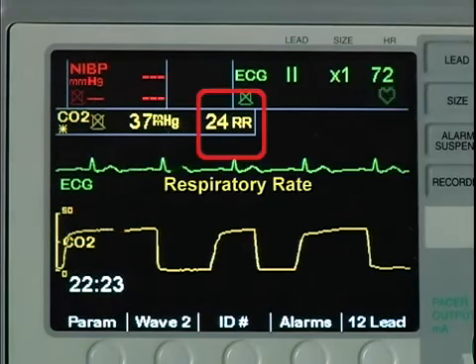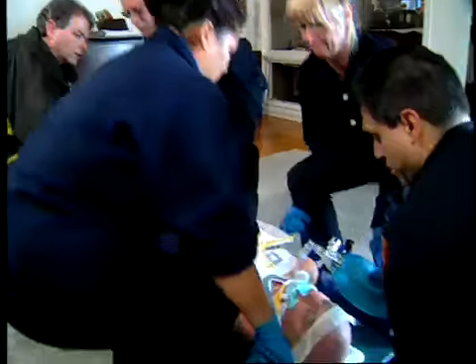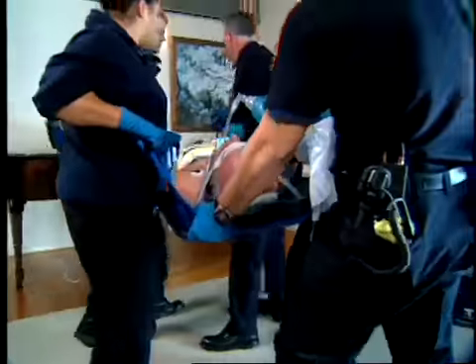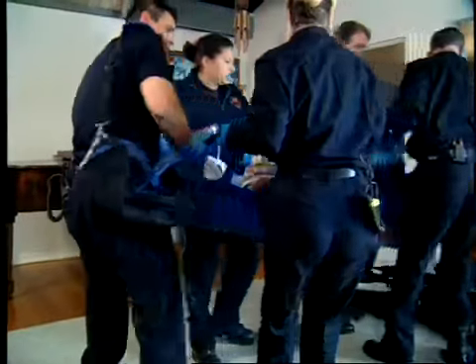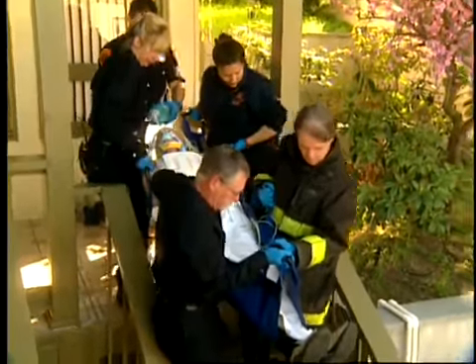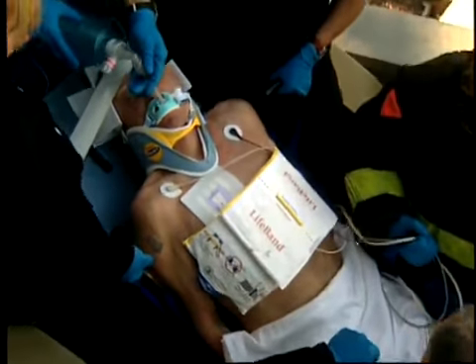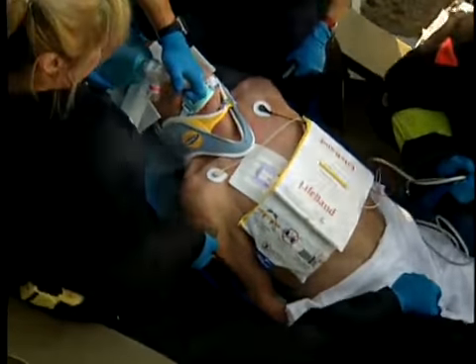In addition to its use for tube verification, continuous capnography monitoring during patient transport gives you a breath-by-breath status on your patient. It's not uncommon for patients to experience certain adverse events when being transported, such as accidental extubation when being moved in and out of an ambulance or from the stretcher to the ED bed, which results in the tube being removed from the vocal cords.